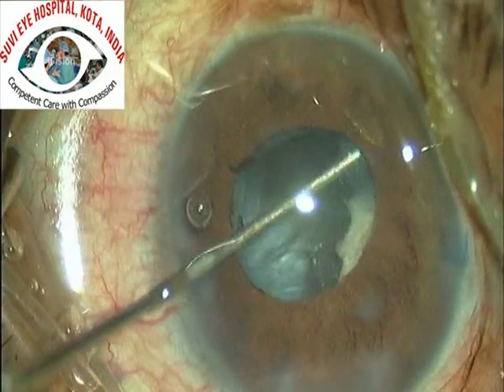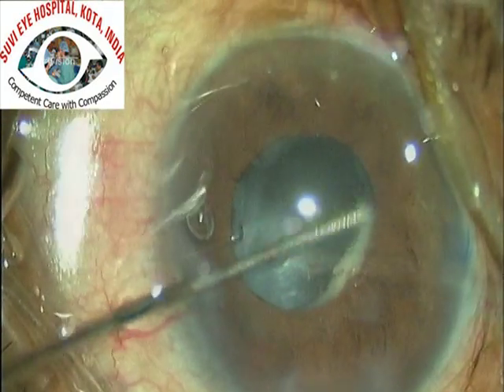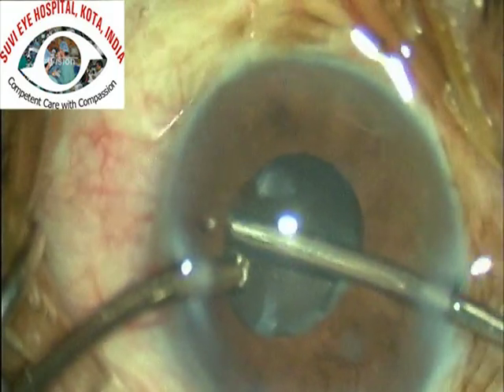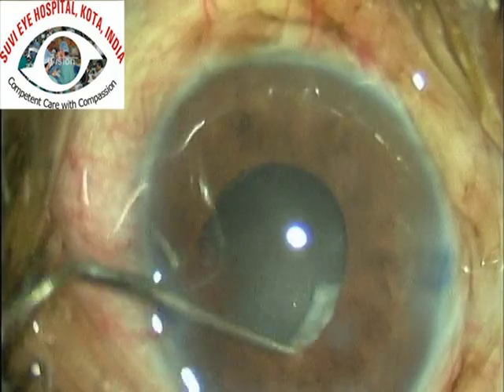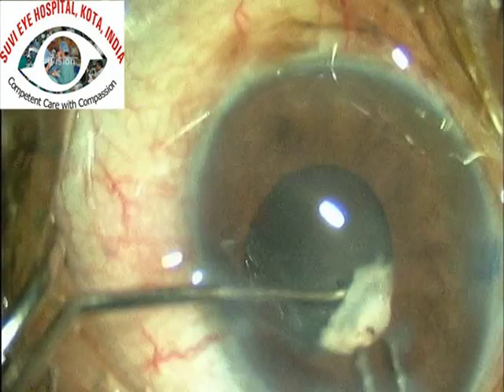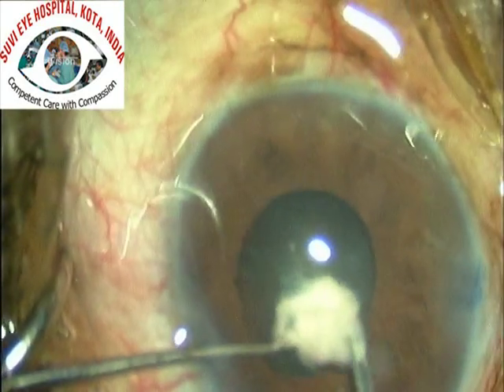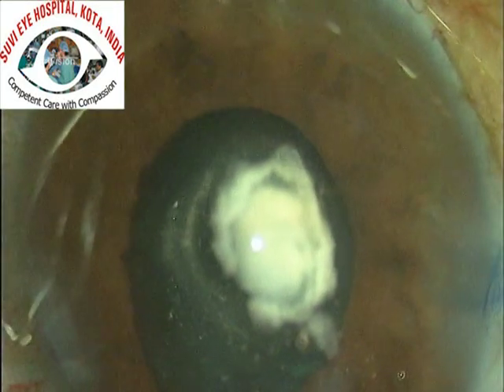We can see that there are some membranous bits lying under the iris which may be very tenacious to remove. We perform irrigation and aspiration, and suddenly we are faced with a capsular plaque that has fortunately come out easily without much manipulation. Otherwise, these capsular plaques on the anterior or posterior capsule are usually very tenacious and extremely difficult to remove.